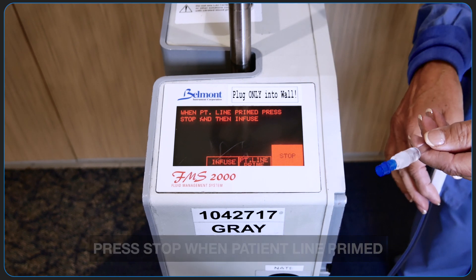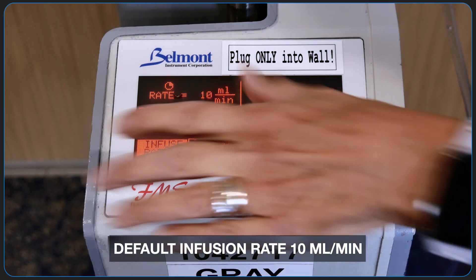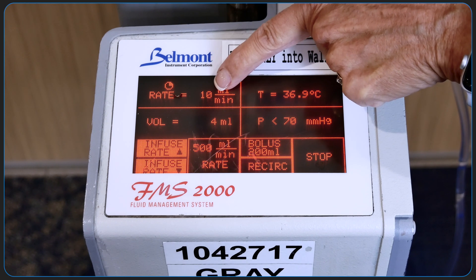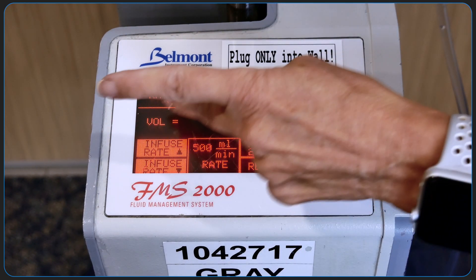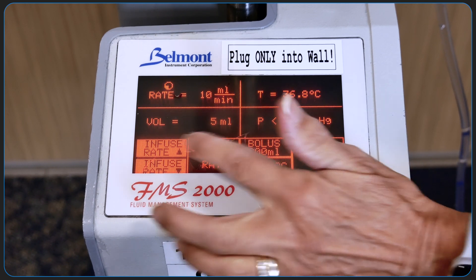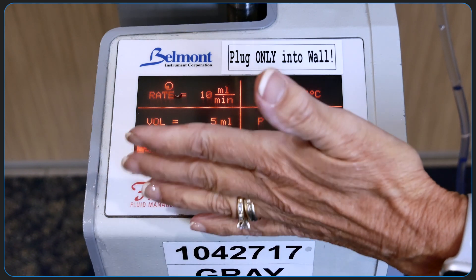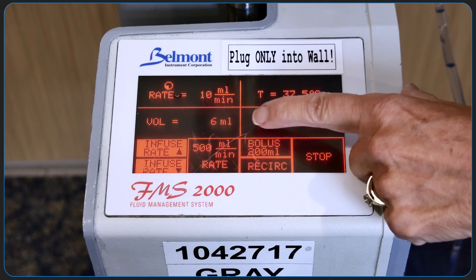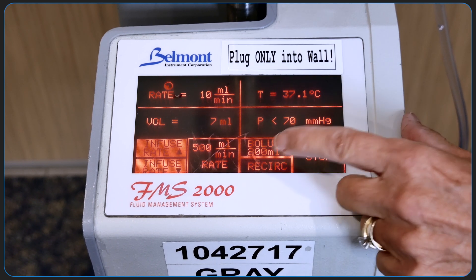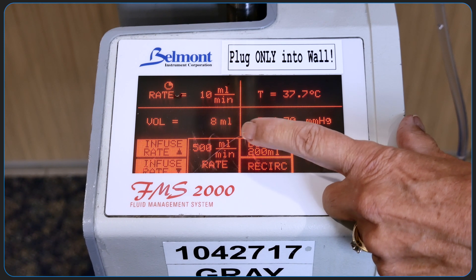At this point, you're ready to connect to the patient and start infusing. As you start infusing, the Belmont is initially set at 10cc per minute. If you want to infuse immediately at a rate of 500cc per minute, you can press this button here. You can also adjust the infusion rate with the up and down arrows. This box represents the temperature in the line, and this is the pressure in the line. If you want a bolus, you can hit this button to administer 200cc — this volume can be adjusted.